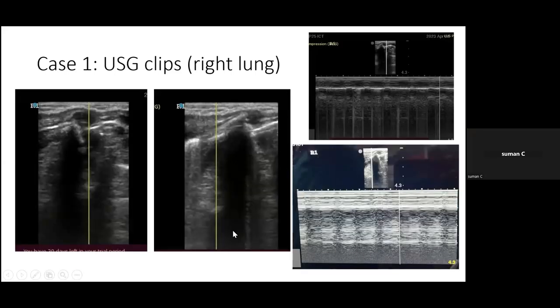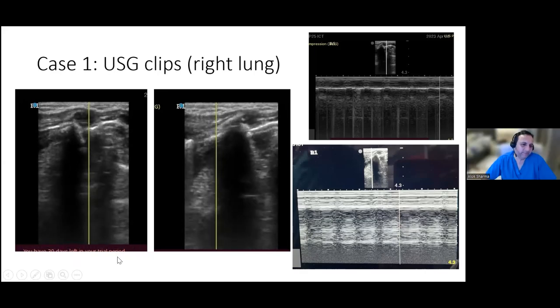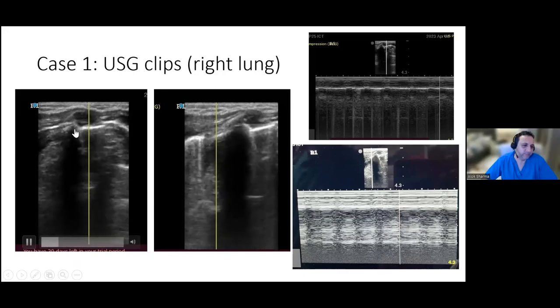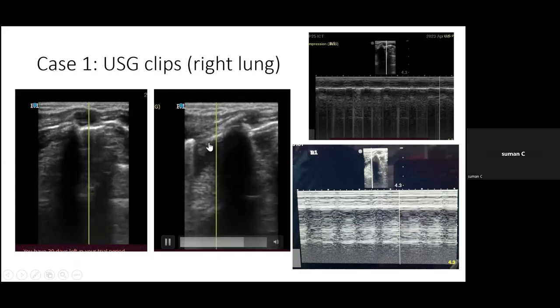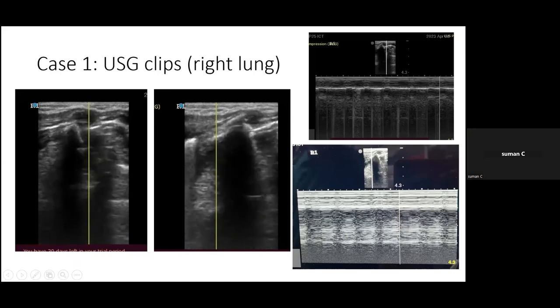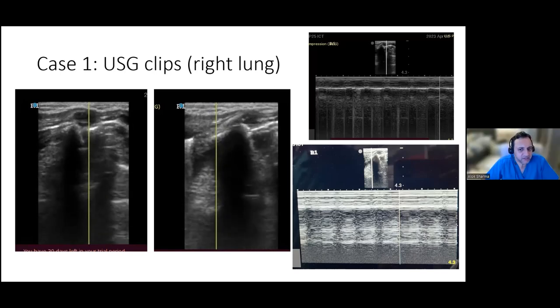So moving on to the next one. Because we had this prior idea that there is this distress and the transillumination sign was positive, so I did... beautiful. A little bit more effort. And here you see the pleural sliding is here and here. Yep. There is no sliding in between. This is a lung point here. Both of these are R1. On M-mode, in this image it was not that clear as a barcode. This one is looking more clear, though I feel that there is this transition occurring from seashore sign to barcode, in the upper slide.